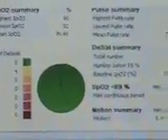So again, we only see a screening. We don't know what body positions he was in, or really how long he was actually sleeping during it. I do know that he doesn't have a lot of movement there, so I wouldn't think he was awake all night long. So as a basic screener, this one tells you I could feel comfortable as a clinician just treating snoring without having to go through the whole rigmarole of a sleep study and whatnot.